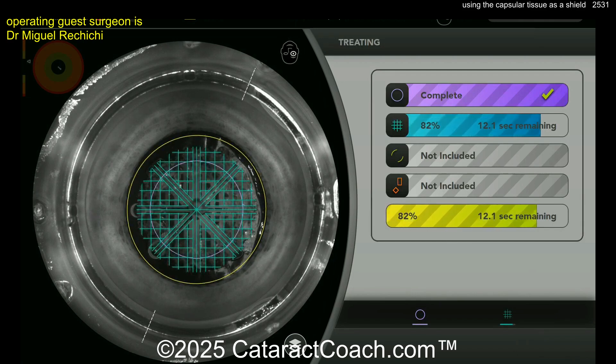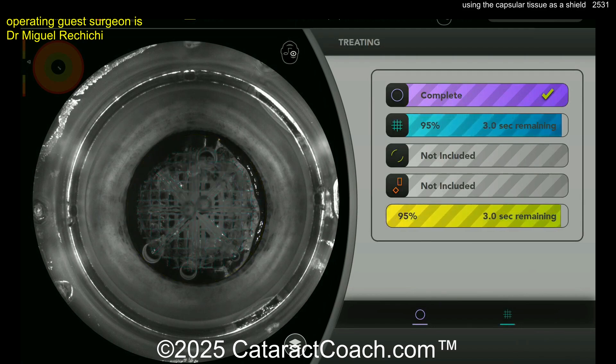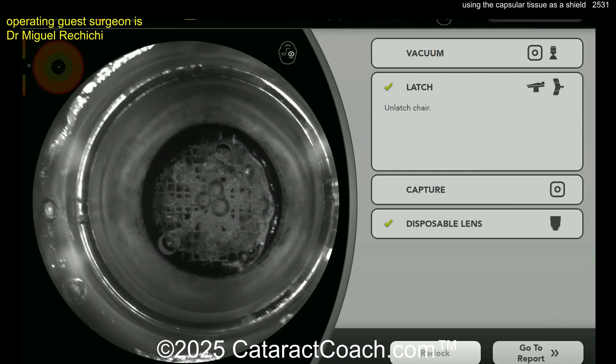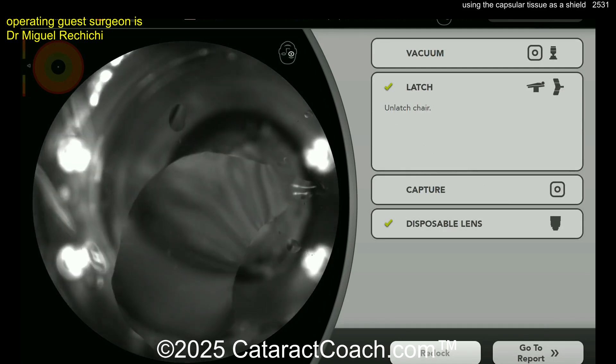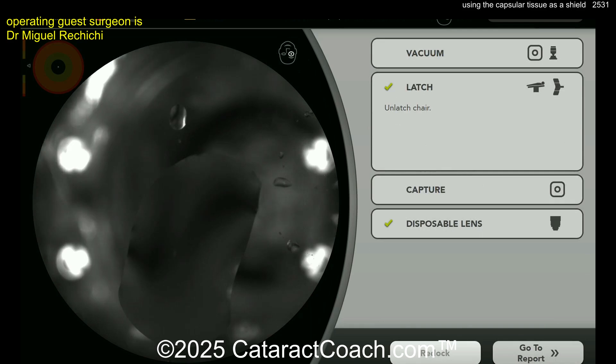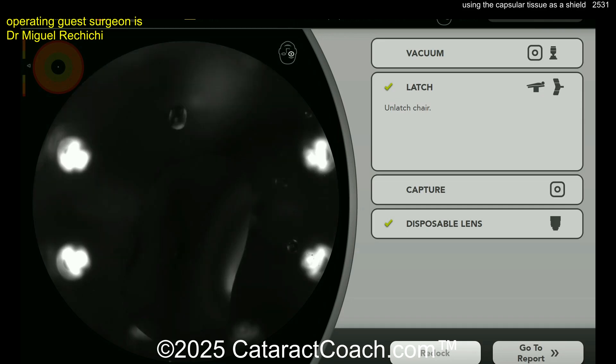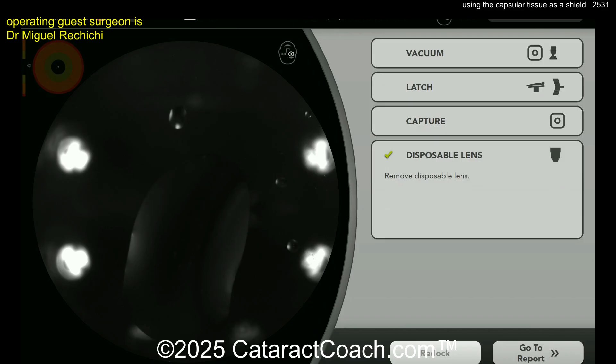Finishing up the femtosecond laser — you can see it's not a very fast procedure, you have to take your time. Notice how the surgeon is not using the femtosecond laser to make incisions. A diamond keratome is still a much better way of making an incision than a femtosecond laser. For your main phaco incision, the diamond is preferred. The laser is used for capsulotomy and to soften the nucleus, but not to make the phaco incision for the cataract surgery.